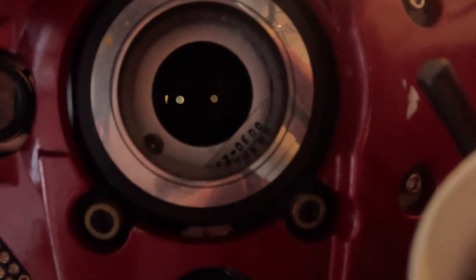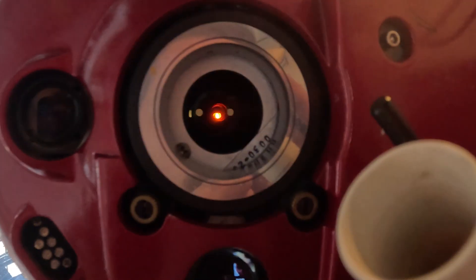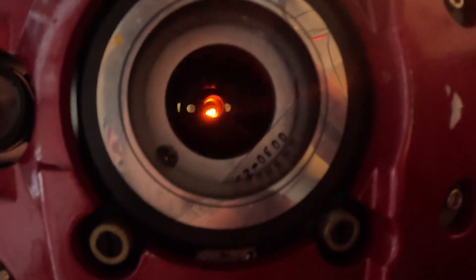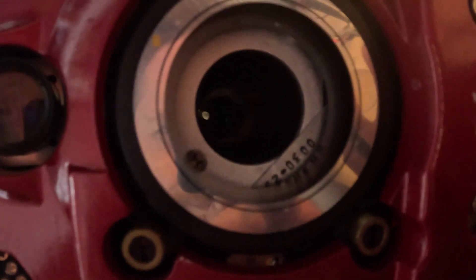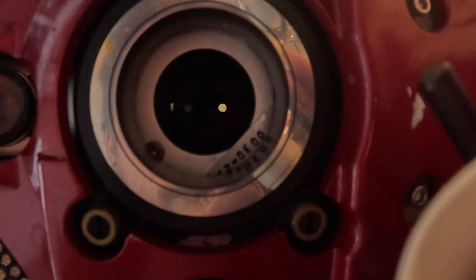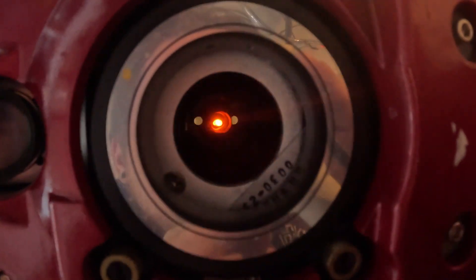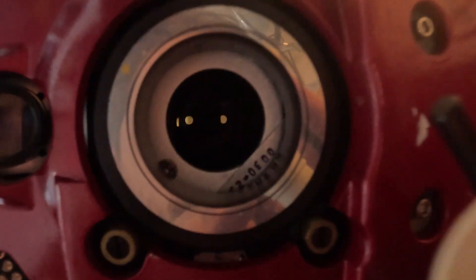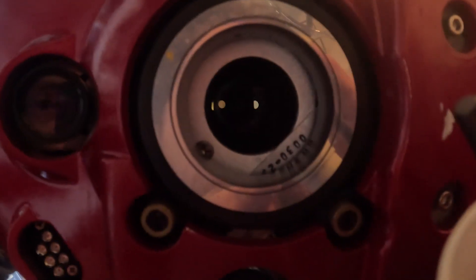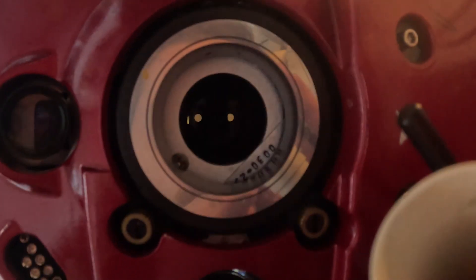You have to open both eyes wide — don't blink or squeeze. Definitely look at the center of the blinking light. Sometimes it looks like a little blob because you're not wearing your glasses or contacts; in that case, look at the bottom edge of the blob and don't close or blink. Blinking right now is just a reflex or habit. You don't need to blink — you don't feel the conscious physical urge to blink because your eye is numb.